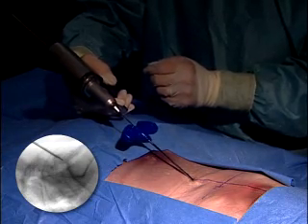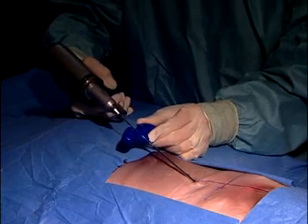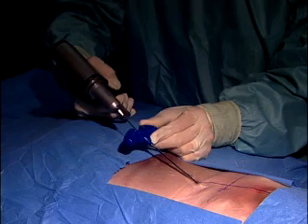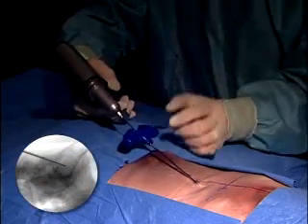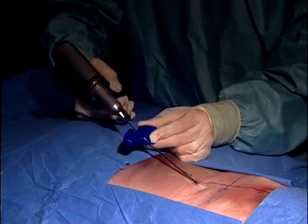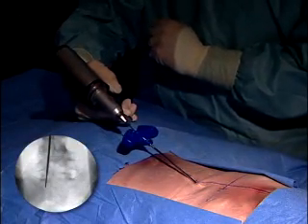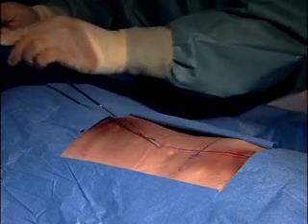This should be accompanied by a series of fluoroscopy images to ensure the K-wire tip reaches the appropriate position and that the trajectory does not change as the wire goes across the facet joint into the center of the pedicle. To assure precise wire placement, confirmation should be assured through an AP fluoroscopy view. The access needle is then removed while maintaining wire placement.